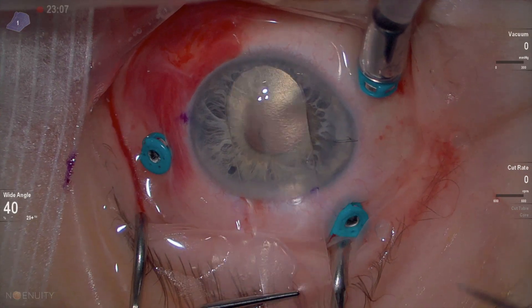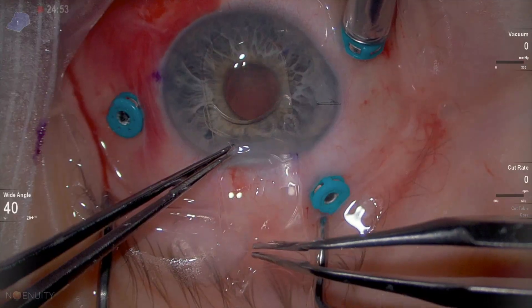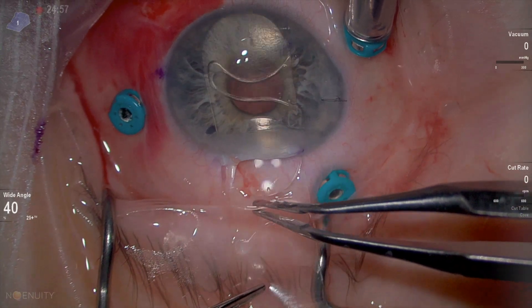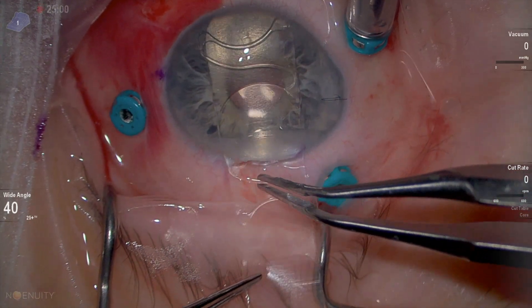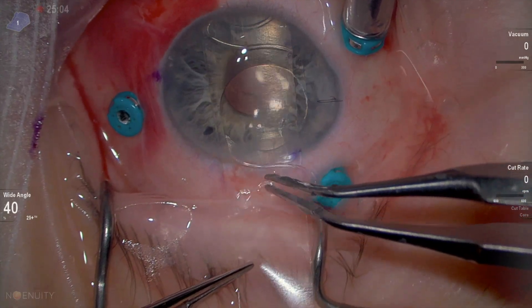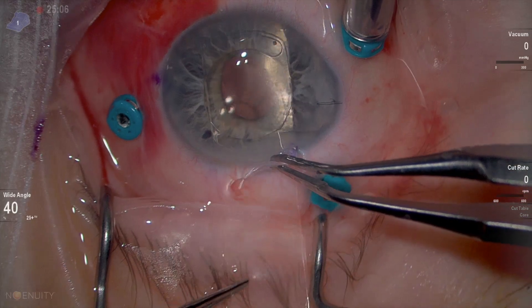The sheet glide is slightly adjusted, making sure it's not picking any iris tissue. The lens is placed in the correct orientation over the sheet glide, aiming for the angle. As the lens moves inside the eye and travels to the angle, the sheet glide is then withdrawn.